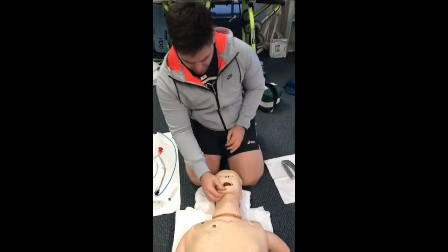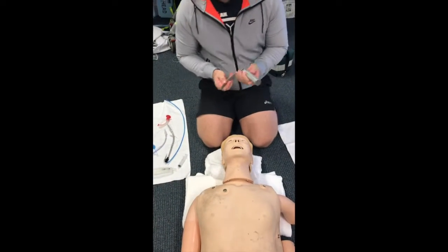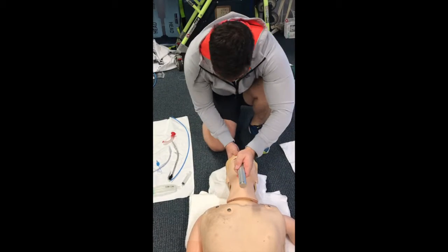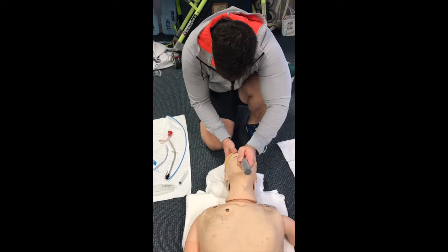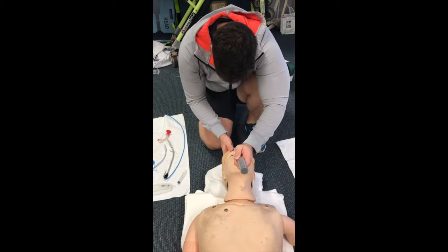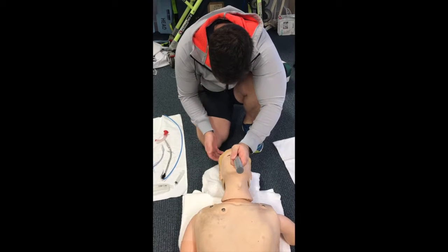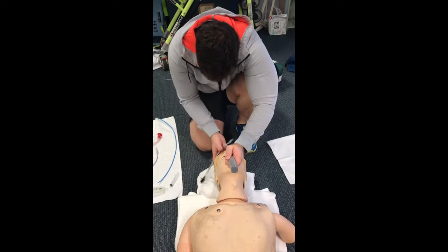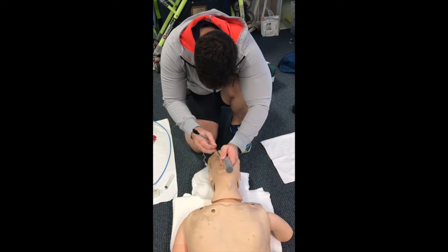Remove my mask. I've got no jaw tone. Grab my size 4 Mac blade, go into the right side of the mouth, sweep the tongue to the left, into the vallecular groove, and I notice I've got a grade 2 view. My assistant would pass me my ETT tube, and I'll go and try to place it.